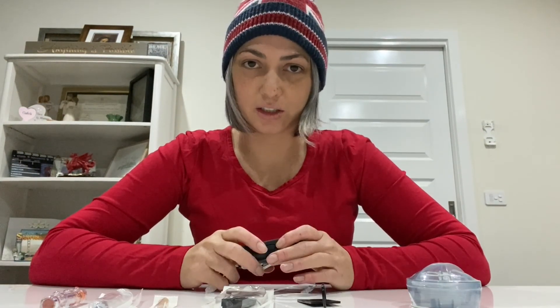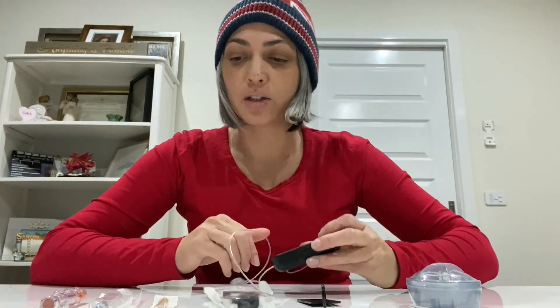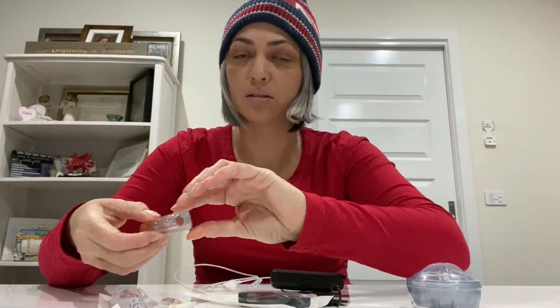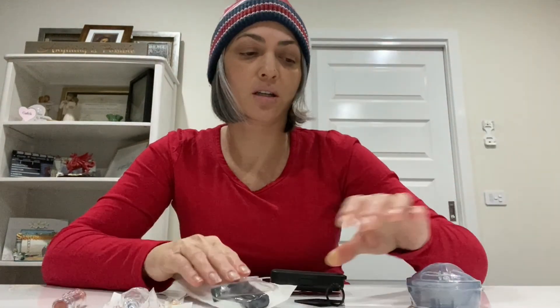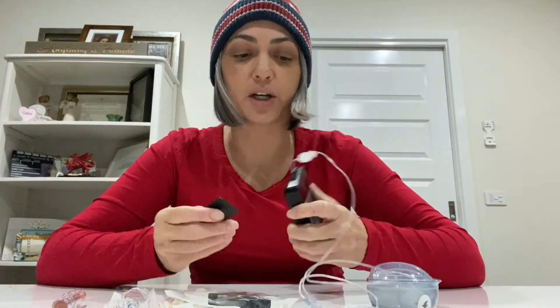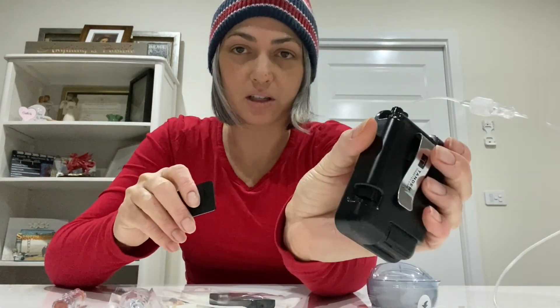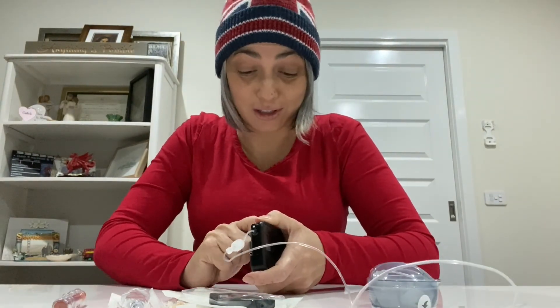I'm about to change my insulin pump cartridge using the T-slim. I have my syringe, insulin, empty cartridge, the line or the site — I need to change my site today — and a little clippy thing that helps get out the old cartridge. First, I'm going to pop out the old cartridge. Sometimes it's easy, sometimes not.